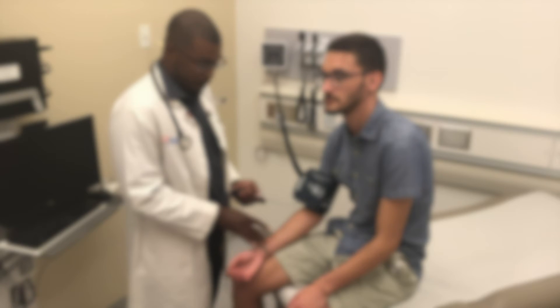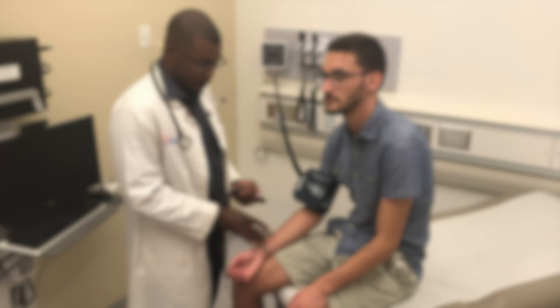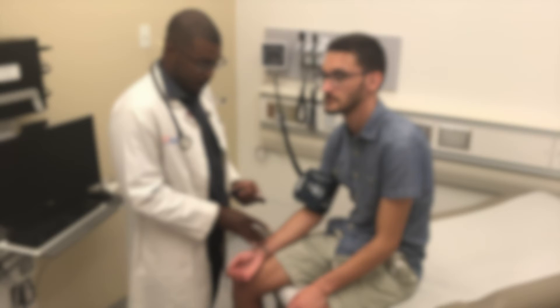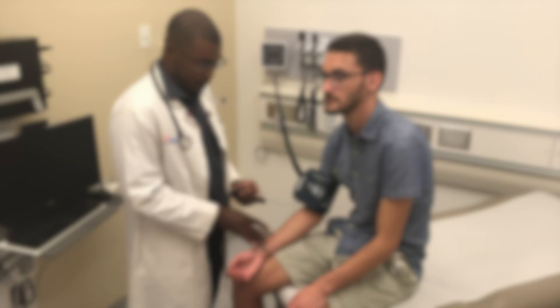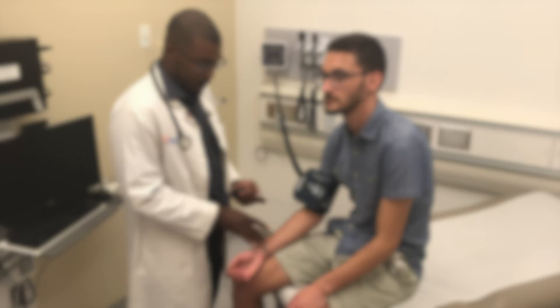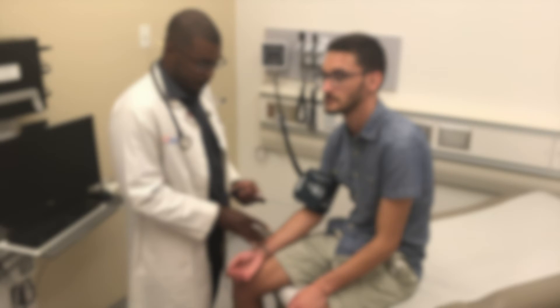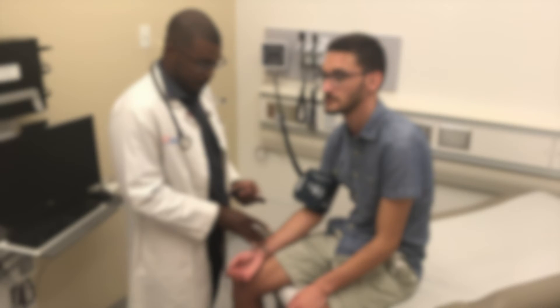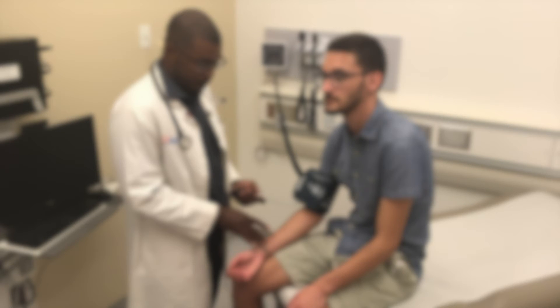To perform this special test, place the blood pressure cuff on the patient's arm as you normally would. Next, palpate the radial pulse. While palpating the radial pulse, begin to rapidly inflate the cuff, and continue inflating until the radial pulse disappears and is no longer palpable. Note the pressure at which the radial pulse disappears, and add 30. Deflate the cuff completely, wait 30 seconds to 1 minute, then retake the blood pressure by the standard method, but this time inflate the cuff to the pulse obliteration pressure plus 30, instead of 180.